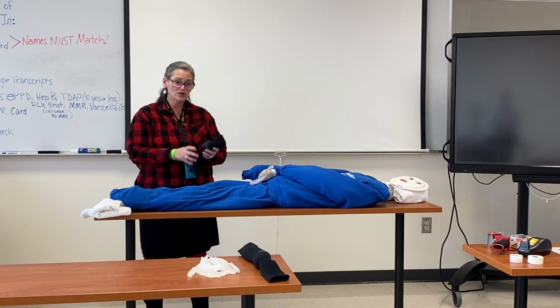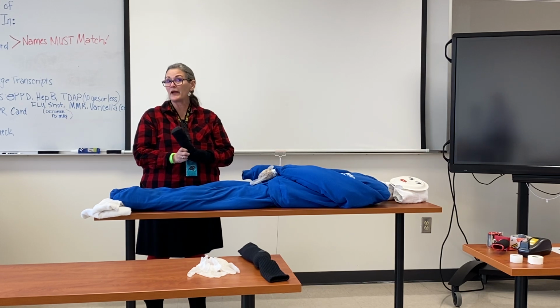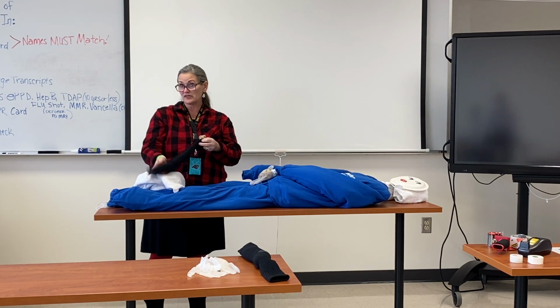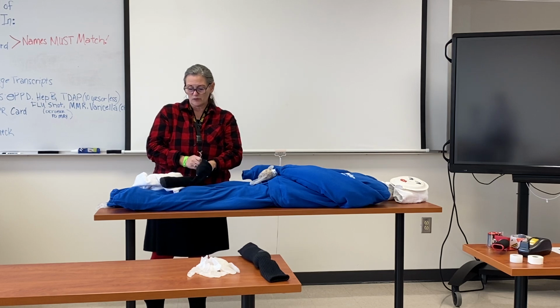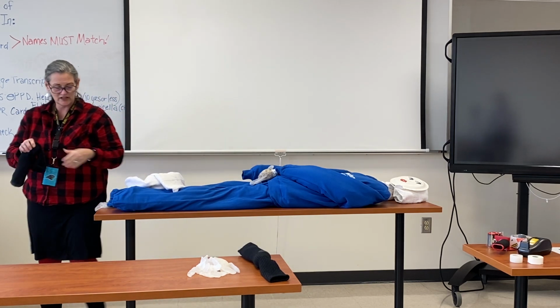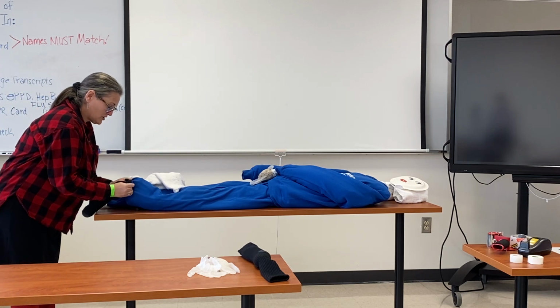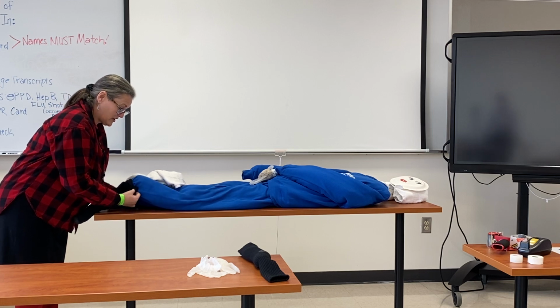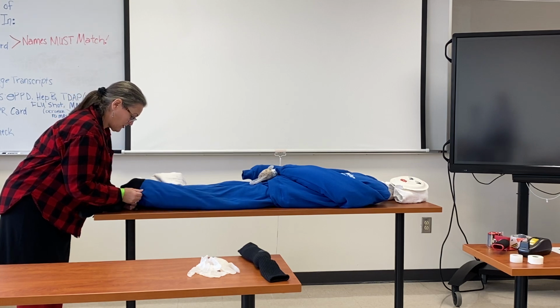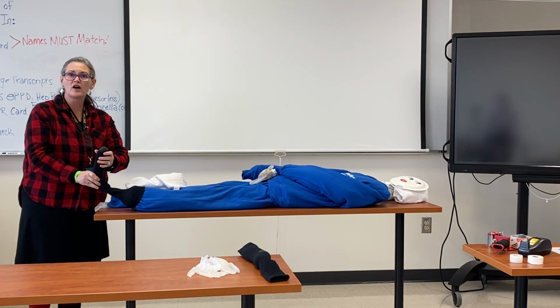Another thing that you're gonna need is a pair of socks, okay? You'll need a pair of socks, and you can just use some paper towel, you can use washcloths, whatever you wanna use, but you need to stuff the sock. And the reason I like for you to stuff the towel all the way, or the blanket all the way down to the foot is on one of these legs, you need a foot, okay? So what you can do is just pull your sock up over the end of the blanket, just like this. And now Granny has a weird looking foot, but it's a foot. The more you stuff the sock, the more you fill out the sock, the more it will look like a foot.